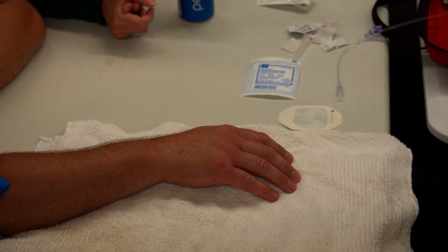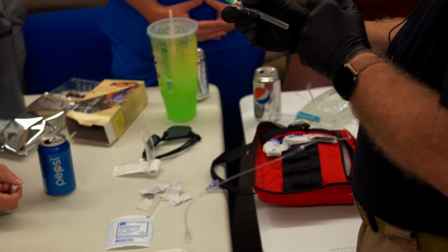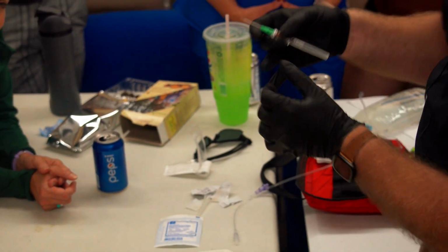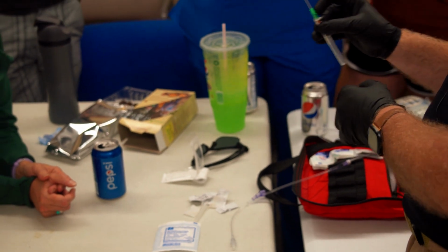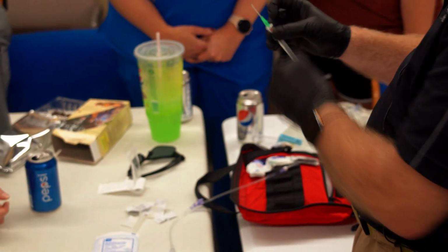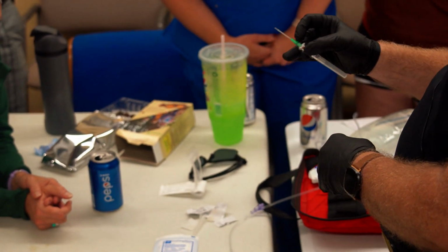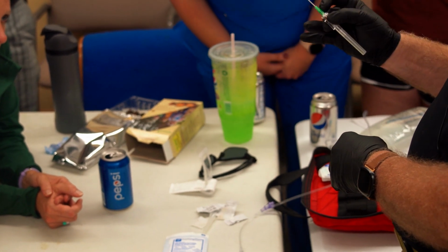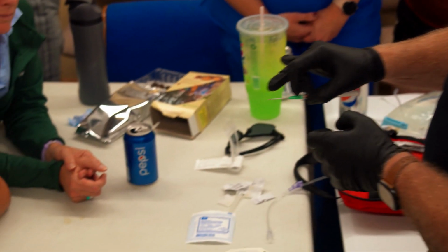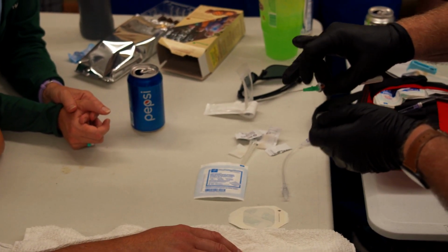So I do my little bit of break the seal. There's a little tab on there. So just here, I'm just twisting that hub a little bit, so if it's kind of stuck on itself. Got it. And this tab kind of helps me steer it. So this goes this way, and I keep back pressure on that tab while I'm going in. This is keeping back pressure, and I can push the whole assembly in. Then I take my finger on the other side of the tab and advance it.